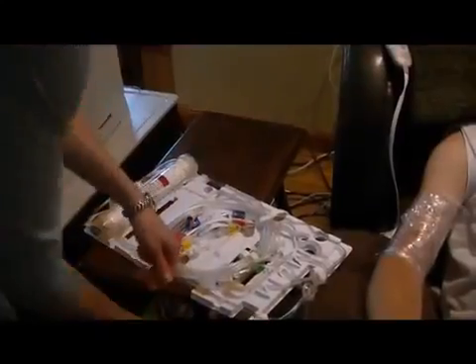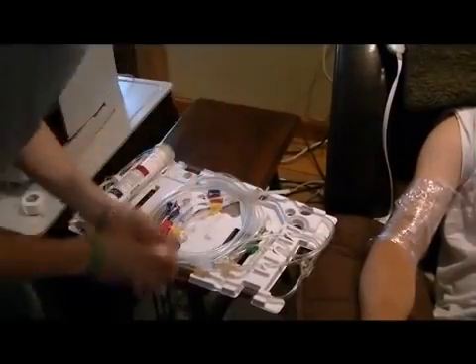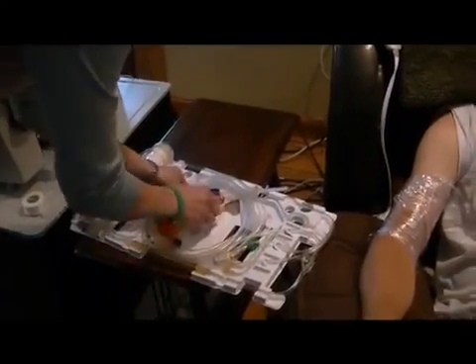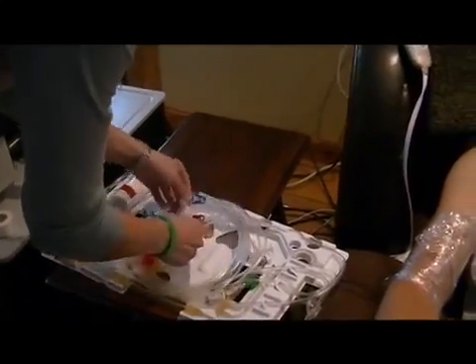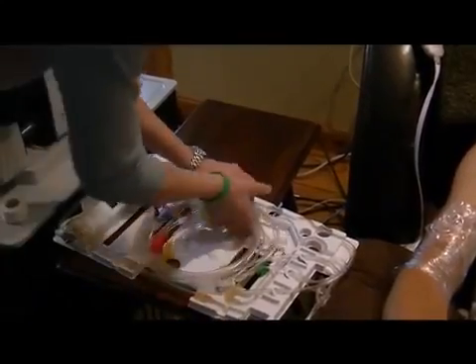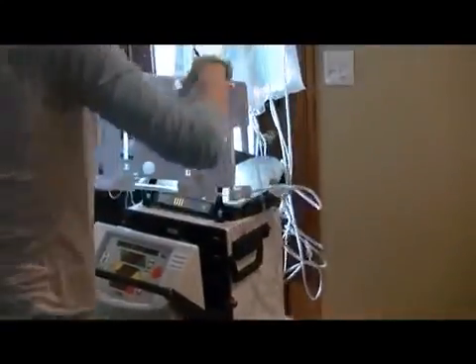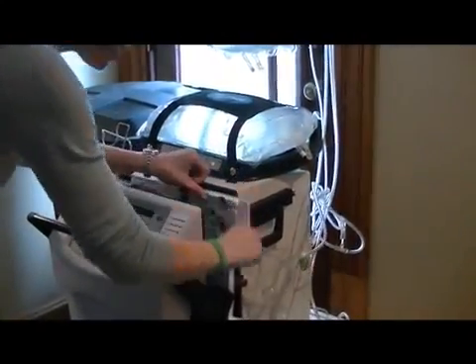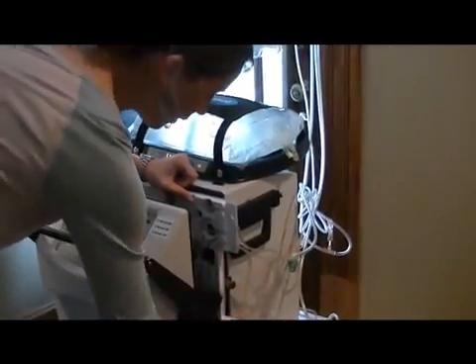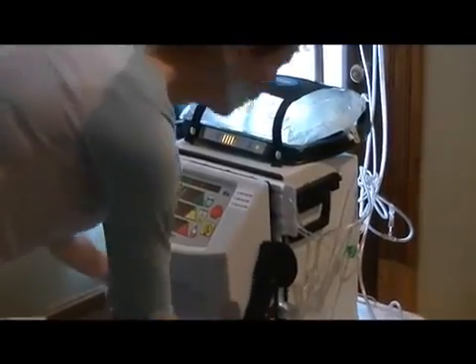This is the cartridge that we use for the machine, and you have to pull off all the tabs and make sure all of the connections are tight. So you just double check all of them and make sure before you put it in the machine. And when you put it in, there's 3 air sensors that you have to make sure get put into place. Close the door.